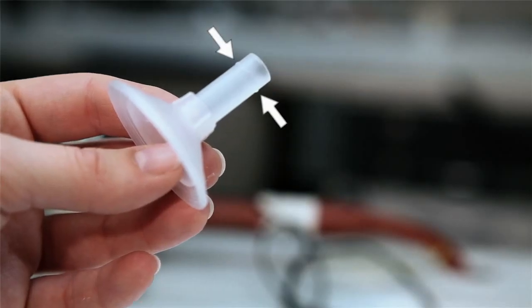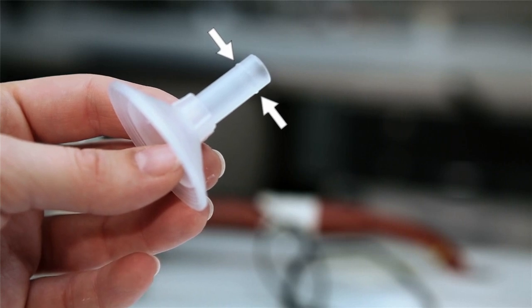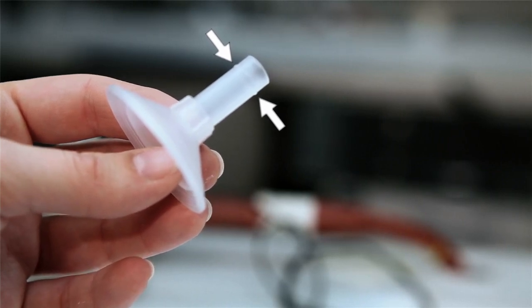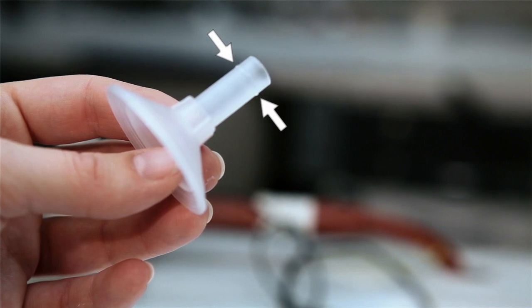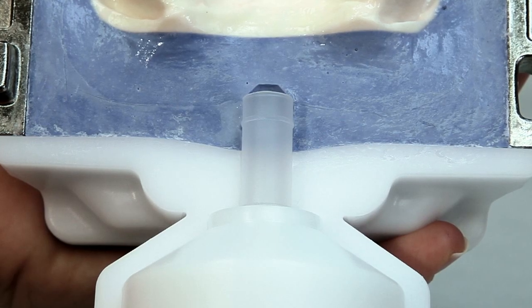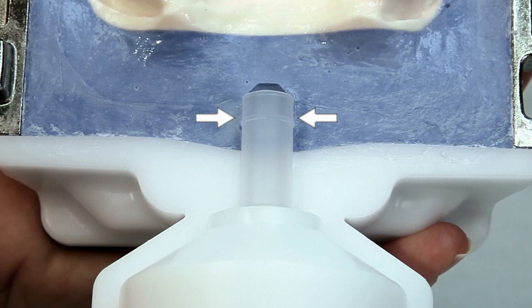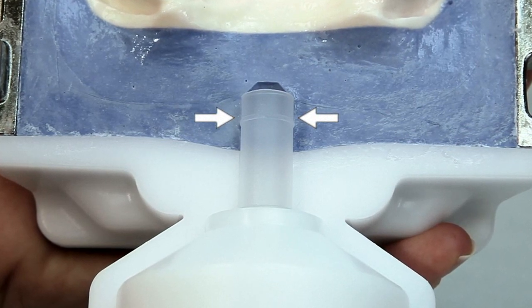During injection, the sealing lip of the funnel is used to seal the hollow space in the flask in the injection direction. Therefore, the funnel must be completely embedded in stone to prevent the resin from escaping the flask.